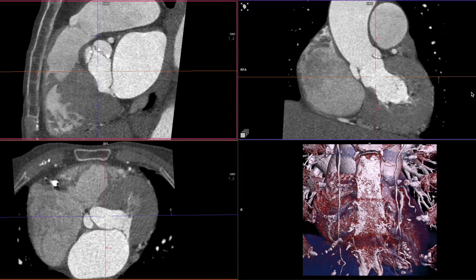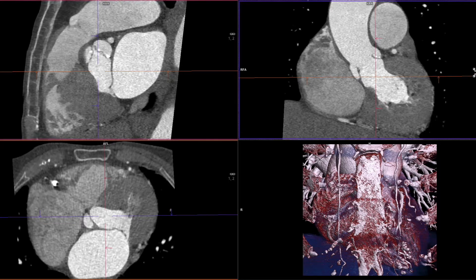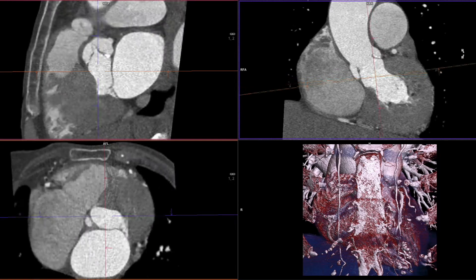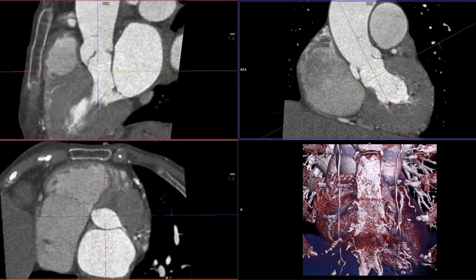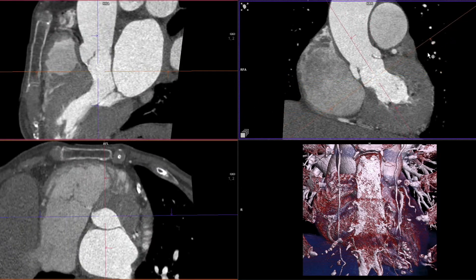This is a rapid method to determine the membranous septum length in cardiac CT. In order to ensure a consistent and reproducible measurement, we define the membranous septum length as the length between the aortic annulus plane and the beginning of the muscular septum.